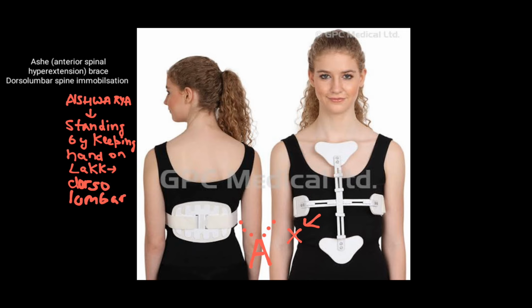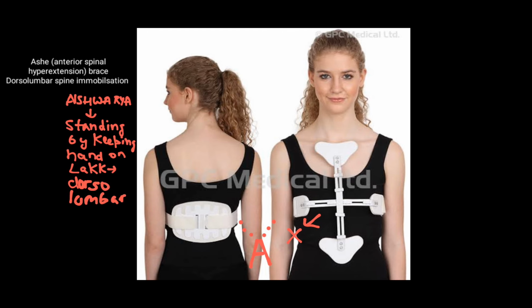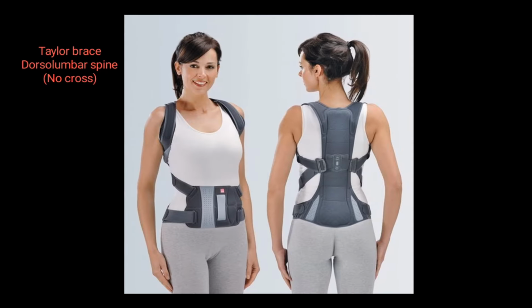Imagine Aishwarya Rai standing by keeping hands on her waist. So dorsolumbar position, okay, dorsolumbar brace. And how will we identify it? If we extend the corners of the A, then it becomes X. So basically there will be a cross or X formed by the brace. So Ashe brace is for the dorsolumbar spine.